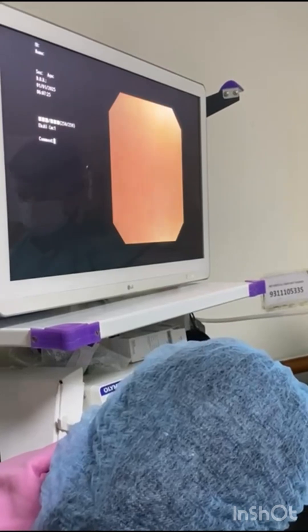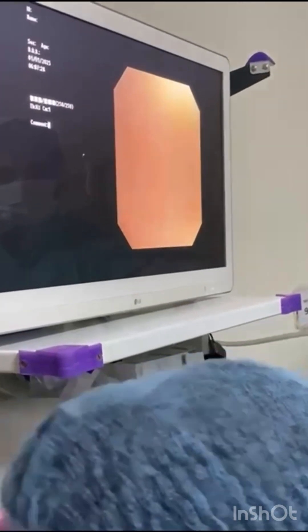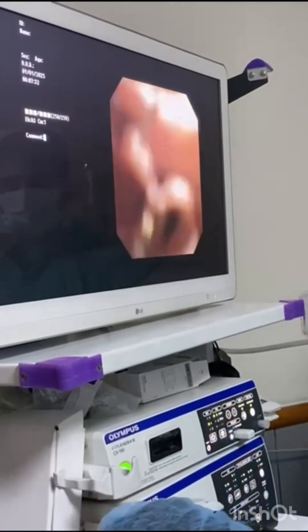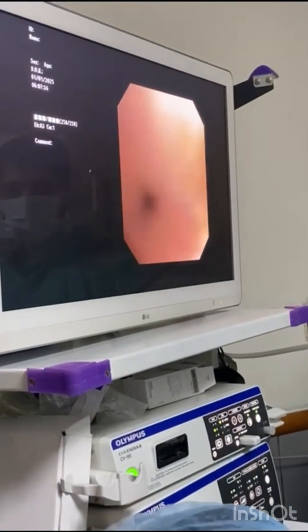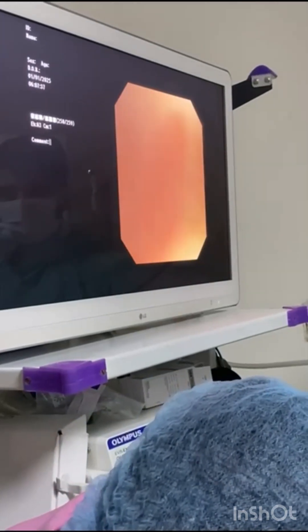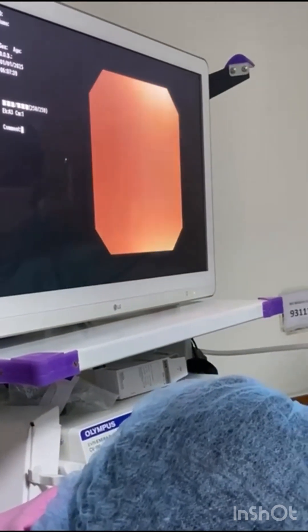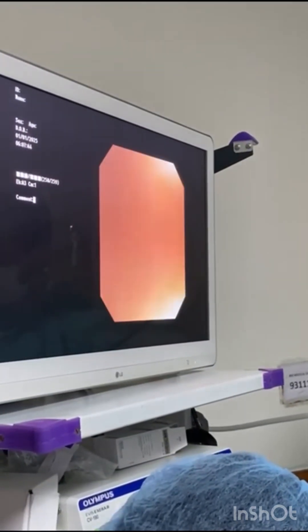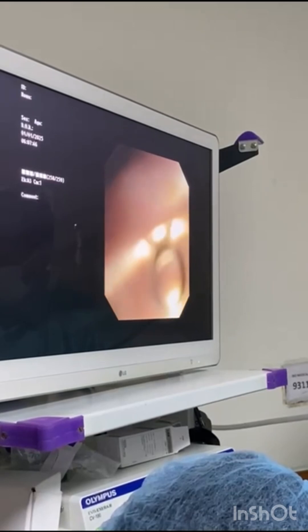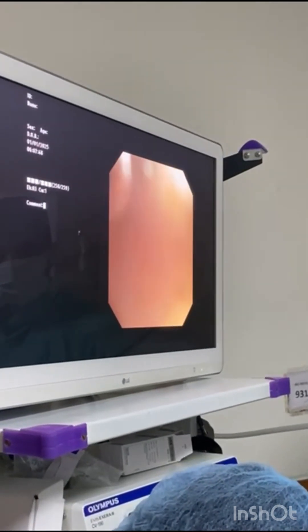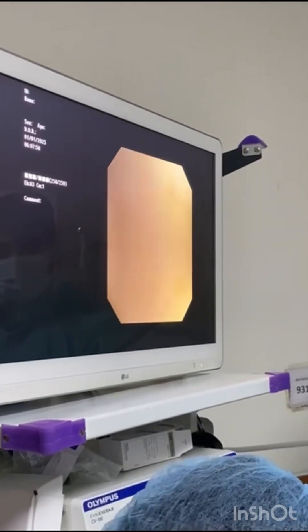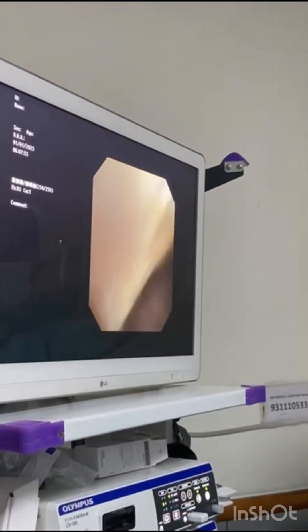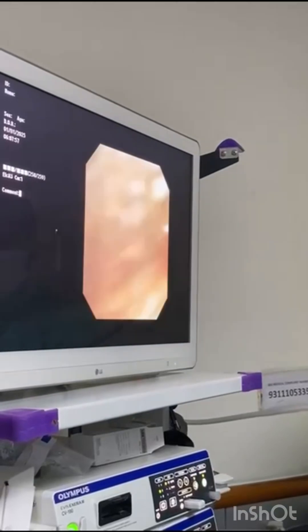The larynx is still not visible, so I am manipulating the tip of the scope so that the larynx will come into the picture. I want to see what type of larynx it is — normal or abnormal. Now the larynx is coming into the picture on the screen. Yes, this is the larynx, and I can see the epiglottis is omega-shaped.